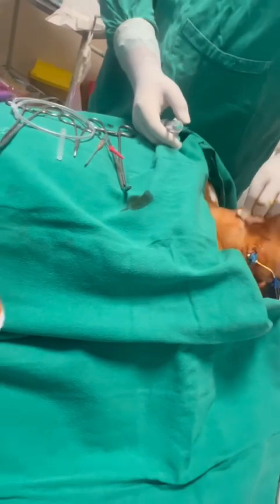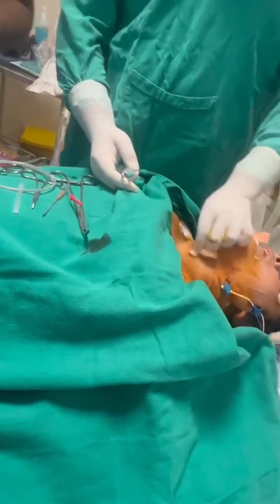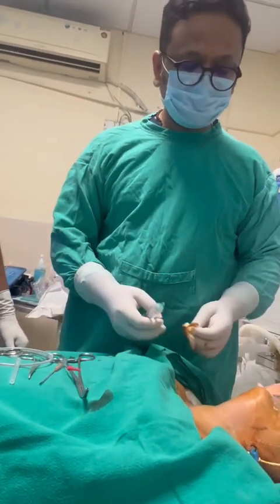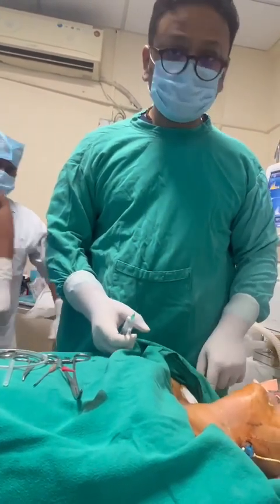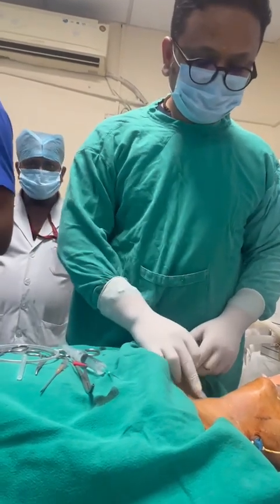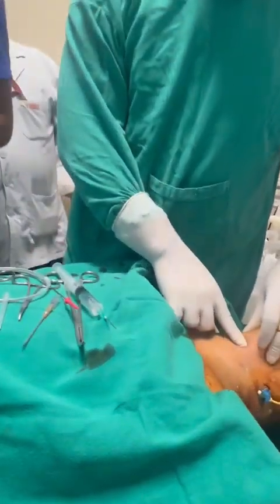This is a difficult anatomy, right? Why is it difficult anatomy? Because the patient is obese, having a short neck, and the anatomical landmarks are not very clear. You have to identify the thyroid cartilage, right? So this one is most likely the thyroid cartilage.